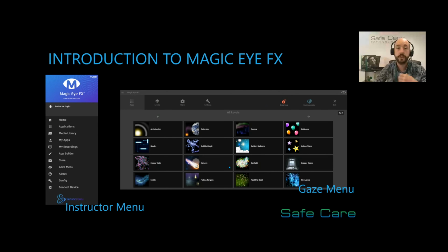So the eye gaze user can actually use the whole software, not relying on anyone else to enter into any apps or exit out of any apps, even to control and go into their own communication software, for example, Communicator 5 and Snapcore First as well.